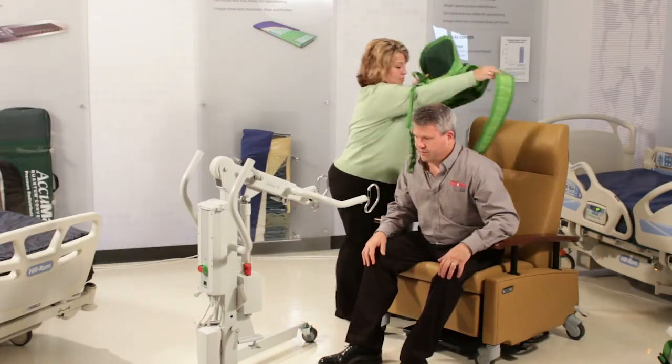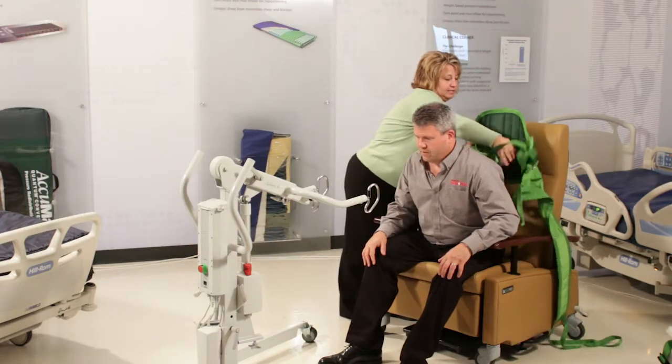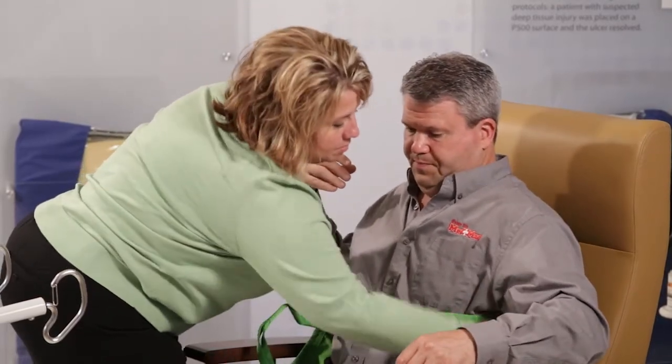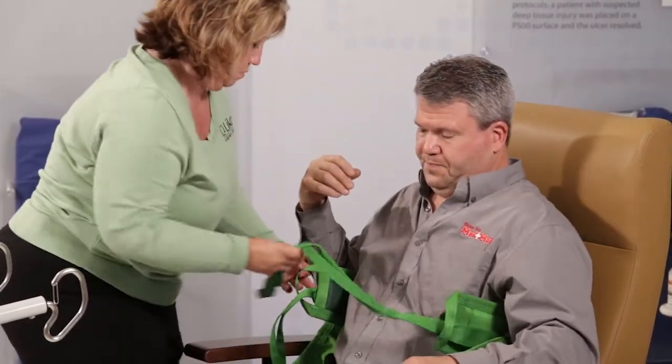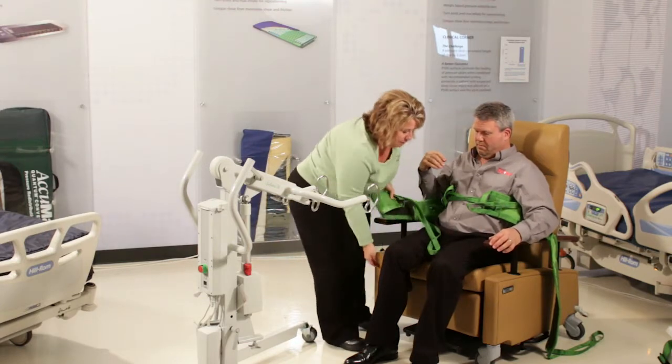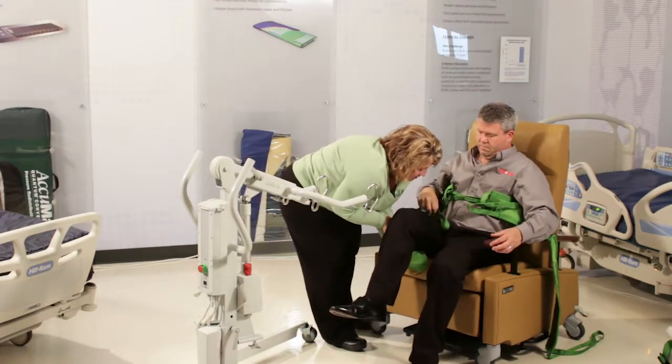The model on this sling for this one is the Model 46. Same cinching technique. Then I need to put the legs on — fold it over and lift the legs so you're not shearing the skin.